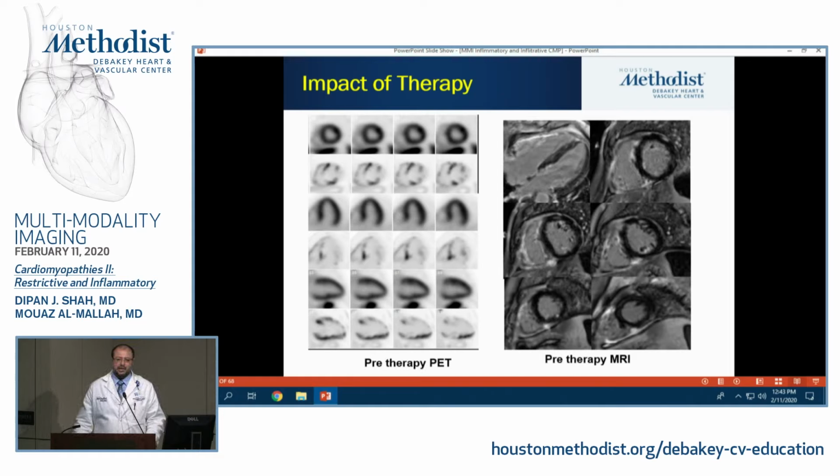I'll show you also a case that came to us. The patient walked into the emergency room with chest pain and palpitations, and had a VT or VF arrest in the emergency room. They shocked him, admitted him, and did an extensive workup. Eventually, he had normal LV function overall, or low normal, and normal coronaries also. And they did an MRI, and the MRI clearly shows some scarring in there, diffuse, patchy, a non-coronary pattern. You can see it in different areas in the anterolateral wall and in the inferolateral wall here.